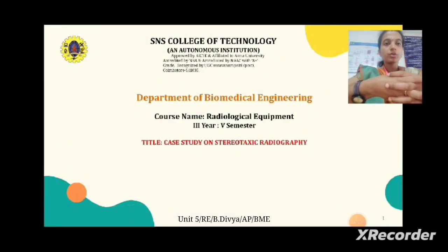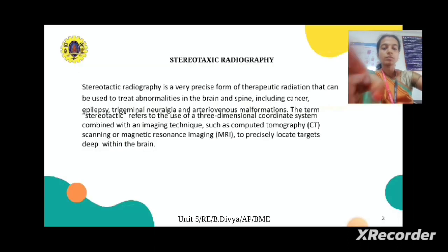In this video, we are going to see a case study on stereotactic radiography. What is stereotactic radiography? It is a surgical procedure which is held on the brain. What is stereotactic radiography?